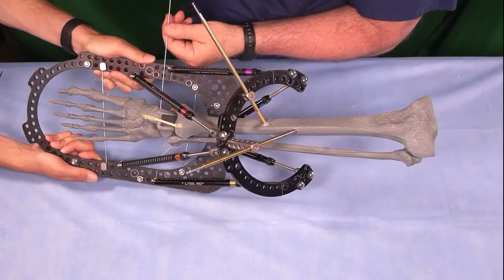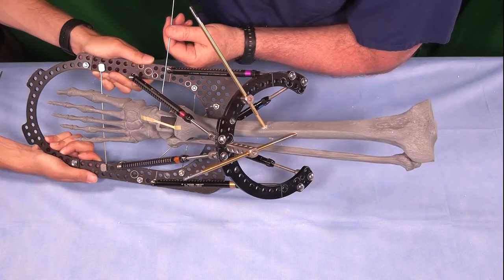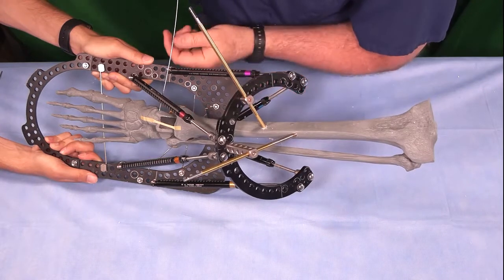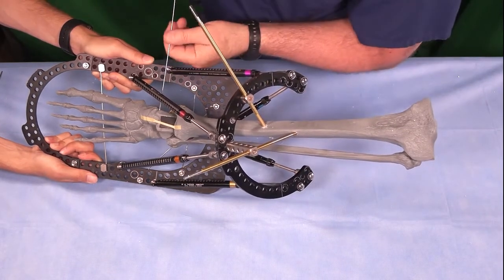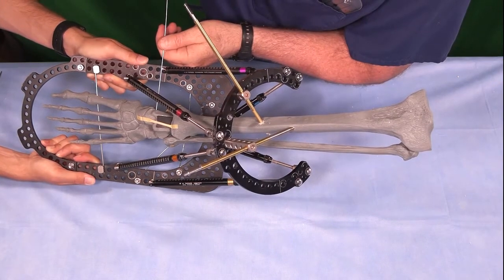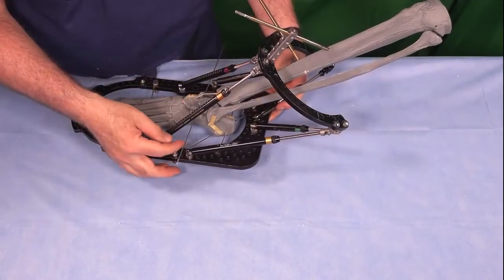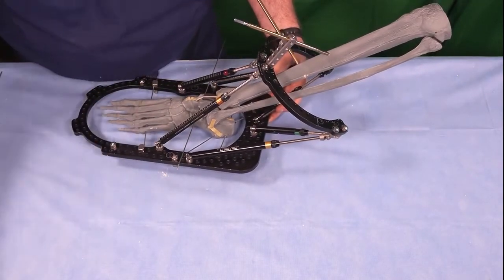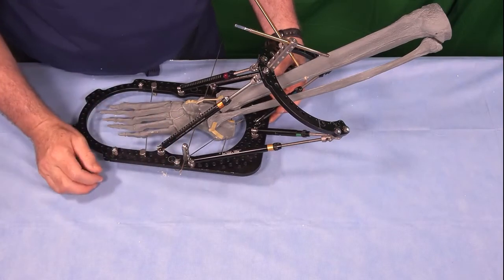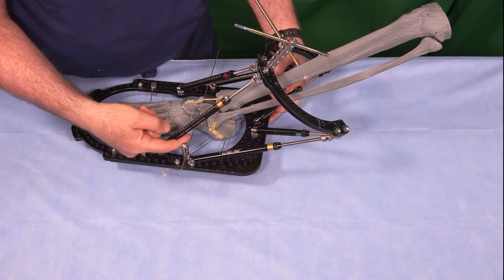I'm going to place one more wire, this one in the neck of the talus, and I can hook onto this wire by suspending a plate inside the ring. But I'm outside of the path of the struts. This wire may be a little bit difficult to connect to. We could use a post. That would work. Alternatively, we can build inside with a plate and up.